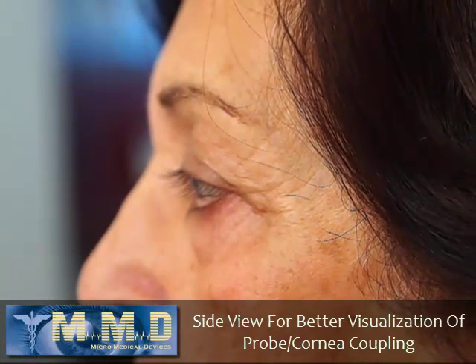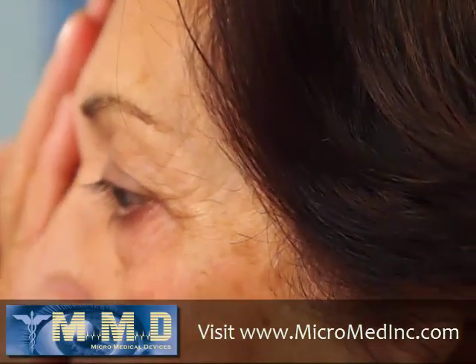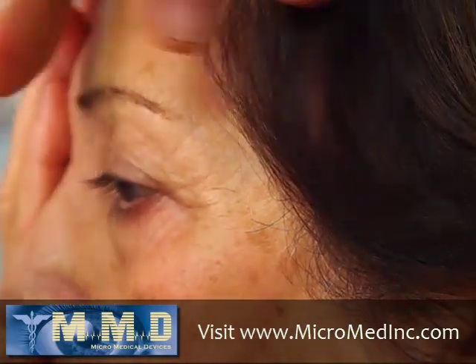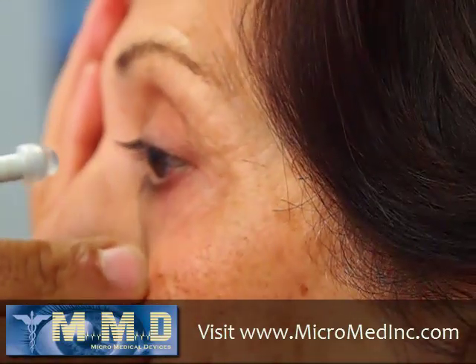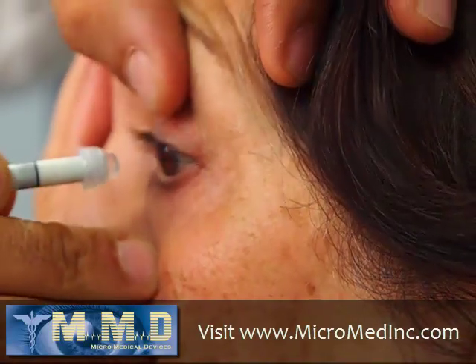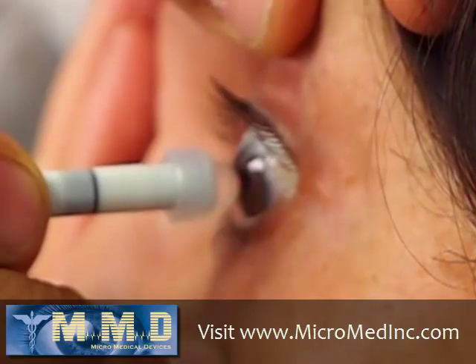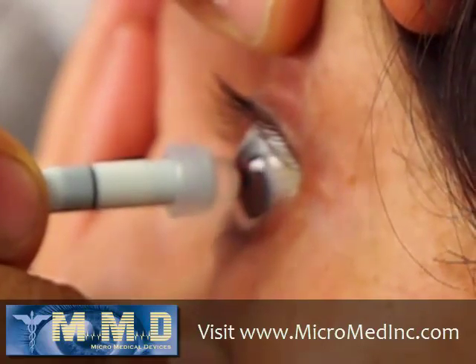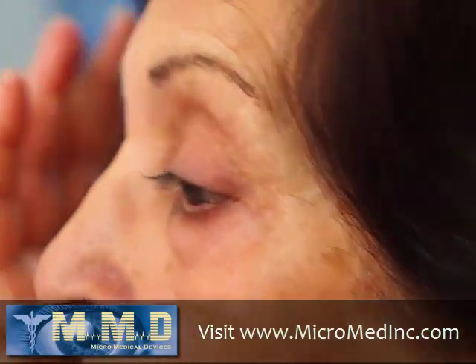Press the scan button and make sure you're in immersion mode. Instruct the patient to look at the blinking light, and just gently come forward until the meniscus is touching the eye. Instruct the patient to look at the blinking light — and you're done.